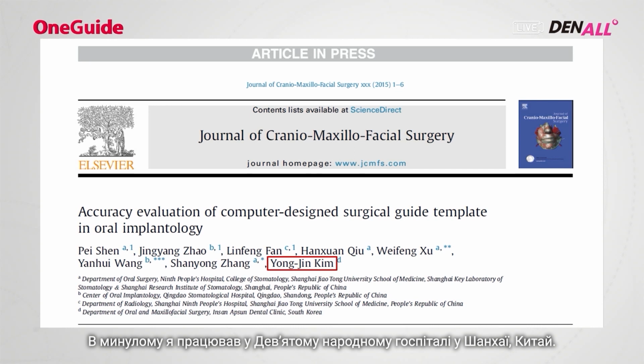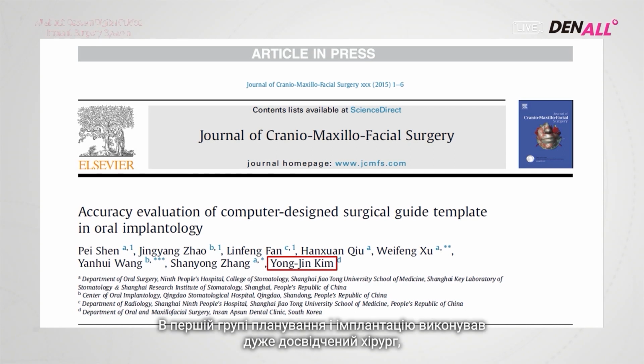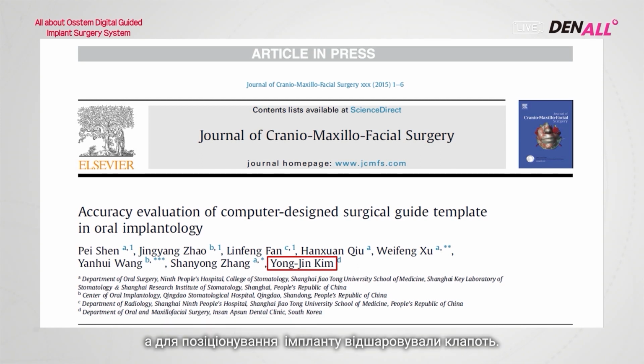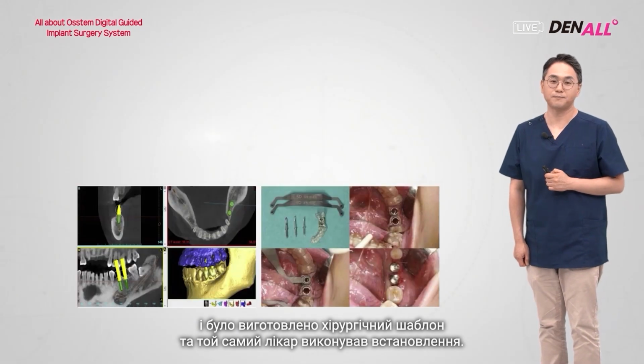In the past, I worked with 9th People's Hospital in Shanghai, China. I did a research there using an implant planning program. The patients were divided into 2 groups. In one group, planning was done, and a very experienced surgeon opened a flap and placed the implant. In another group, using the planned position, a surgical guide was fabricated and the same doctor did the placement.